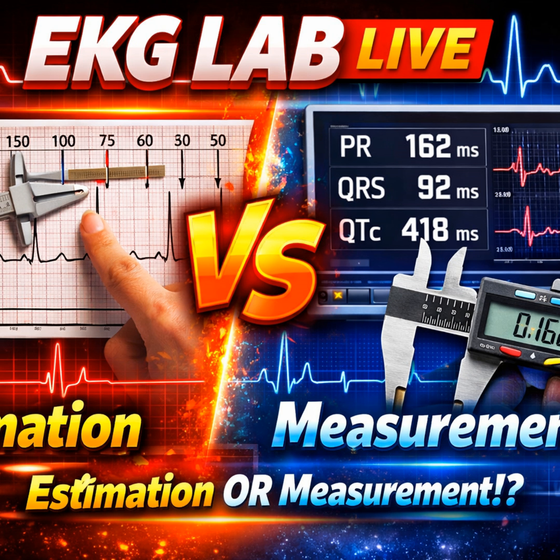If you rely on your gut, you look at the strip, you see a dropped beat, and you might mistake it for Mobitz 2. Which is exactly why I look at the whole strip. But if you mistake Mobitz I for Mobitz 2, you are mistaking a relatively benign condition for one that often requires a pacemaker. The difference is entirely in the small box. It is 0.04 seconds of truth.